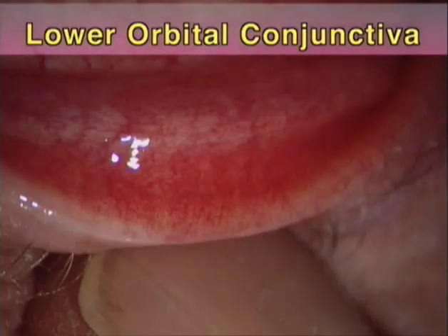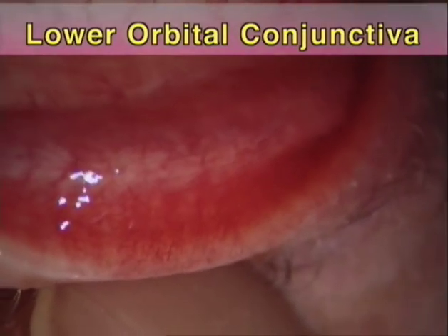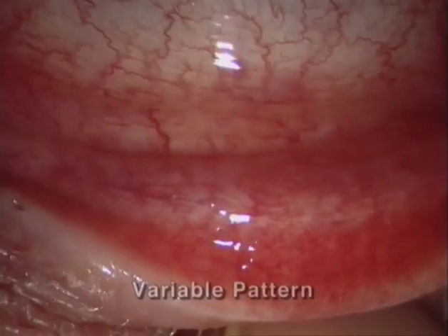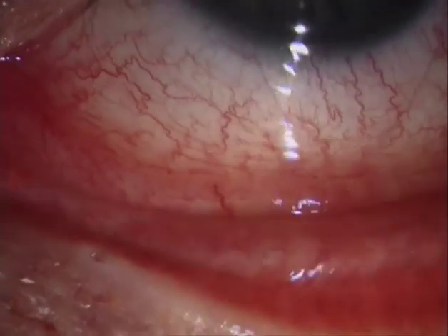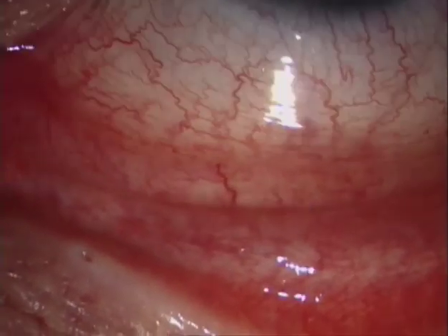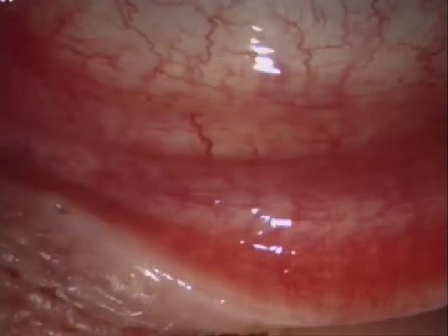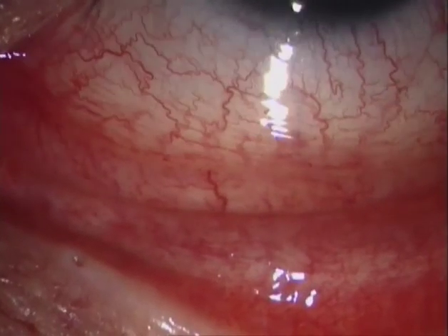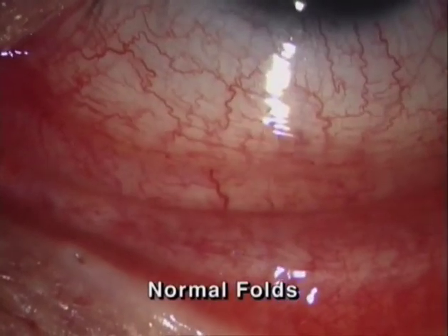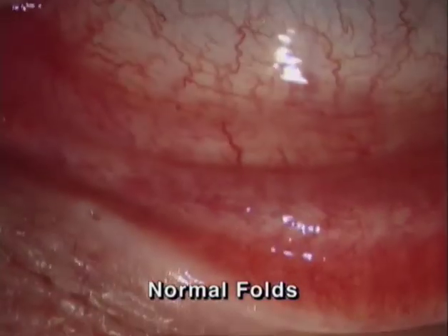Orbital conjunctiva. In the orbital part, the conjunctiva has a highly variable aspect because the underlying tissue is loose, very mobile, and the vessels change their position at every movement of the globe. There are folds in many variations, but in a normal conjunctiva, typically all of them run parallel to the globe.